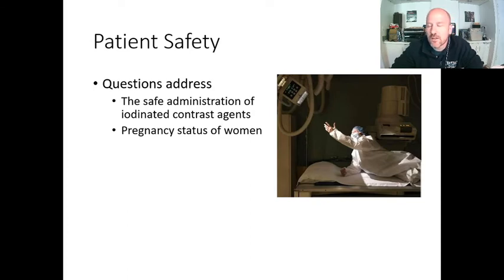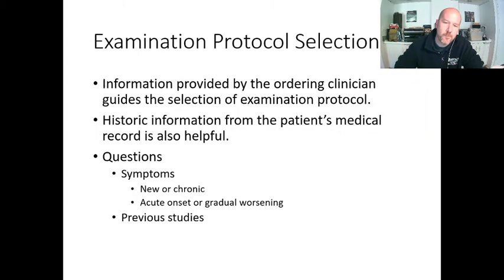And then the other huge concern that we are interested in, probably the bigger issue in some ways, is safe use of IV contrast, because stuff can get crazy real quick. We're going to spend a whole week on that. All right.